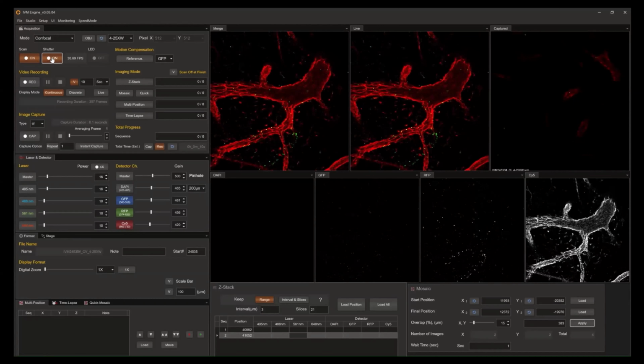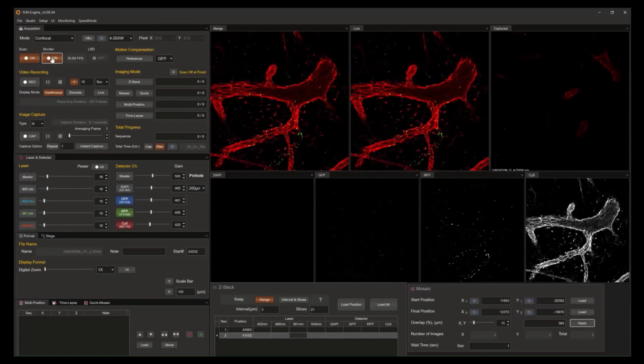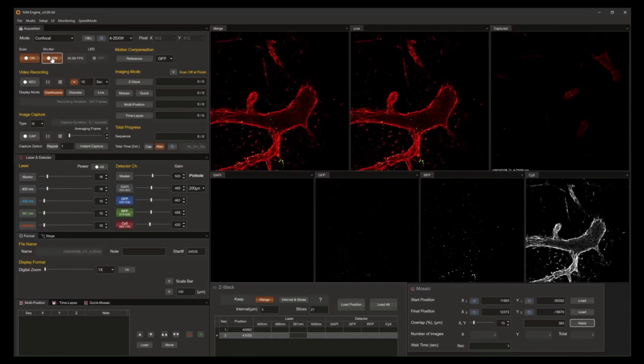Keep an eye out for large blood vessels with multiple branches and vasculature, as they are ideal areas to capture the signals. In this experiment, the red signals represent blood vessels labeled with anti-CD31 antibody conjugated with the fluorescent dyes from the Cy5 channel. And the green signals represent fluorescent particles.